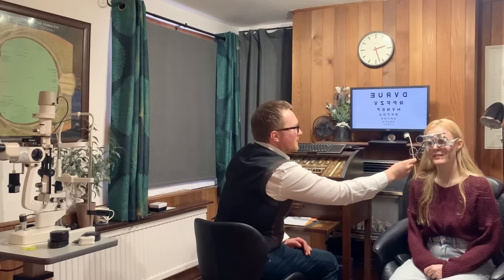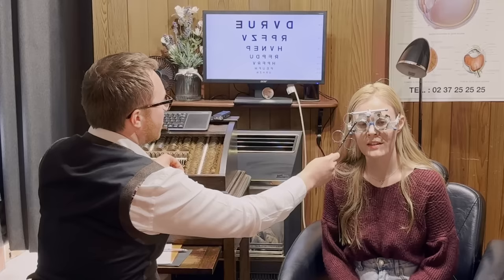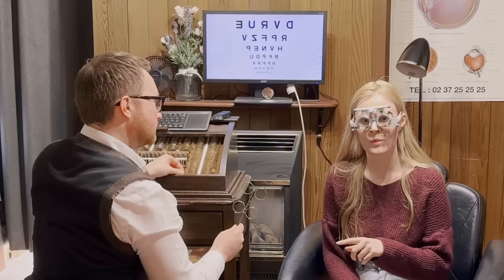Okay. Now if we pop that in front, these bottom two lines, are they a bit more comfortable to read, a bit blurrier, or about the same? So that's with, and that's without. Probably more able to read the very bottom with. With that. Yeah. Well, let's just put this in for a second.